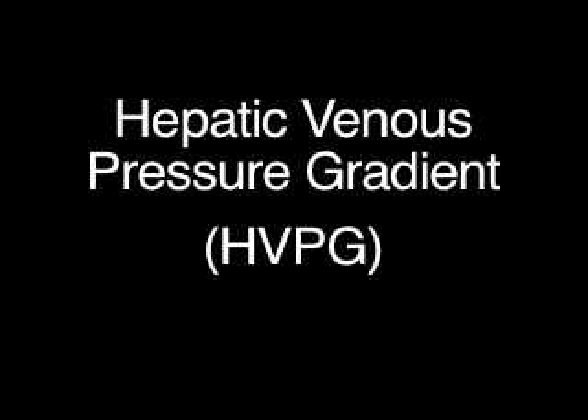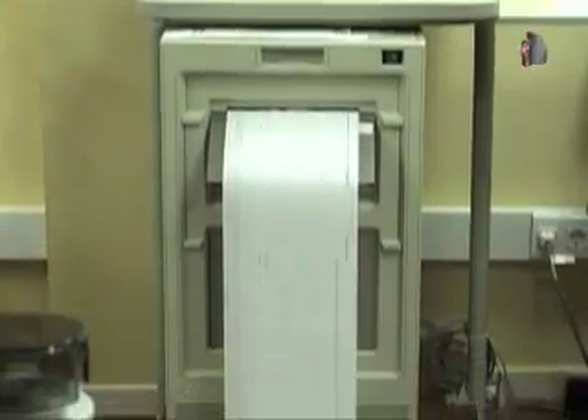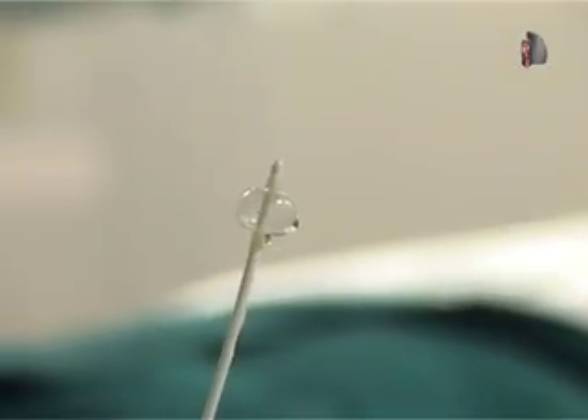The hepatic venous pressure gradient, HVPG, is the most reliable way to measure portal pressure. A digital x-ray fluoroscope and a monitor with a pressure recorder are needed. Measurements are performed with a catheter that has an inflatable balloon on its tip.